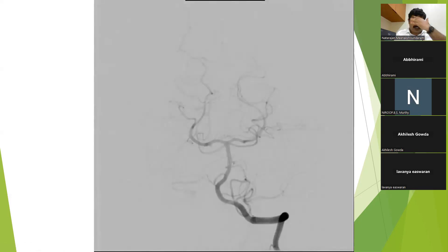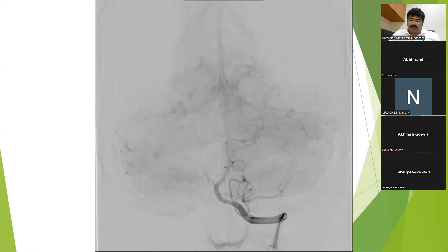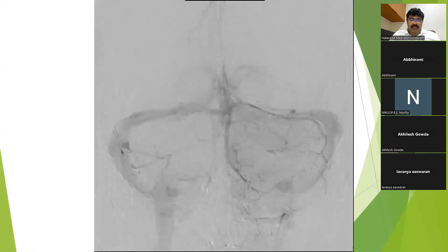This is the vertebral artery projection, which we shall discuss further in the posterior circulation section. This is the vertebral artery and this is the basilar artery. The basilar artery terminates into the superior cerebellar artery and then the posterior cerebral artery. This is the P1-PCA and this is the superior cerebellar artery. The capillary phase and then the venous phase follow.